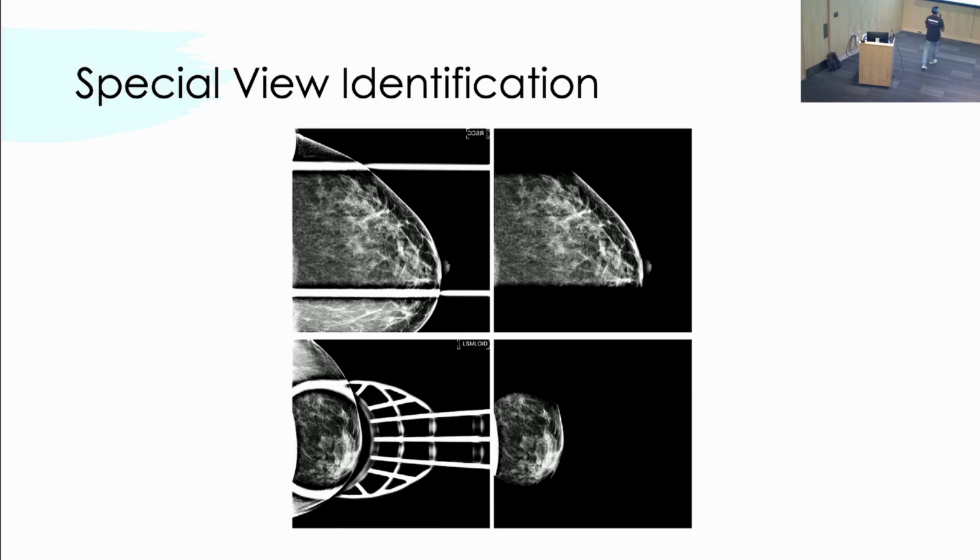So if you put the diagnostic mammograms into your model, and 50% of diagnostic studies have cancer and 1% of screening studies have cancer, what is the model going to learn? Paddles. The model will learn paddles equal cancer, right? So we process the data by removing the paddles and just leaving the tissue inside the paddles, right? So we have that specialist. In the data set, it is identified which mammogram is a special view, so you can throw those out.